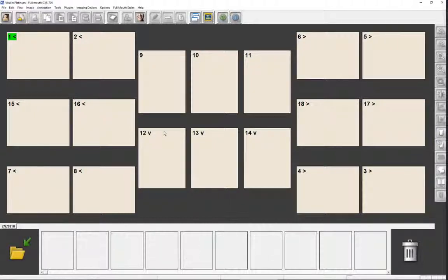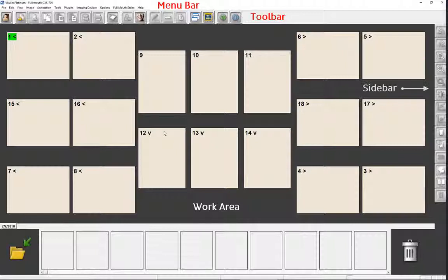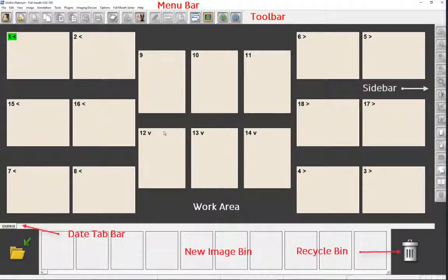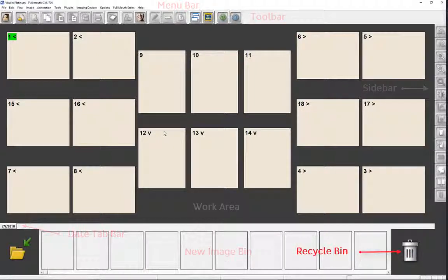In addition to the work area, the interface includes a menu bar, toolbar, sidebar, date tab bar, and the new image bin. There is also a recycle bin to permanently dispose of images.